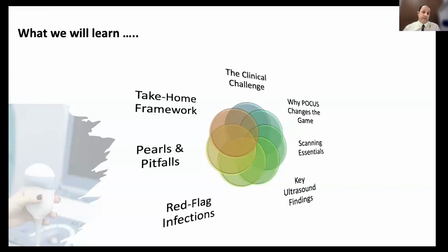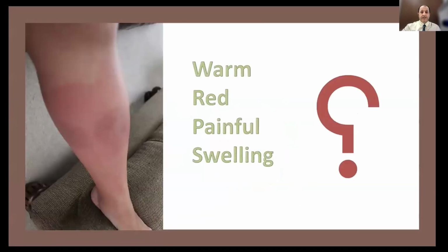If you find red flags, it means a more critical, more serious case, and we need to be more invasive in the treatment of such cases. We will also cover the pitfalls to consider in point-of-care ultrasound. Finally, we will sum up our discussion on how we can approach a soft tissue infection in the emergency room or in an ambulatory setting. So this discussion is not just for the emergency room. Every clinician can use it in an ambulatory setting, critical care, maybe the ICU or the emergency room.